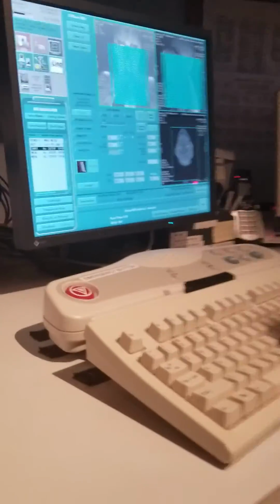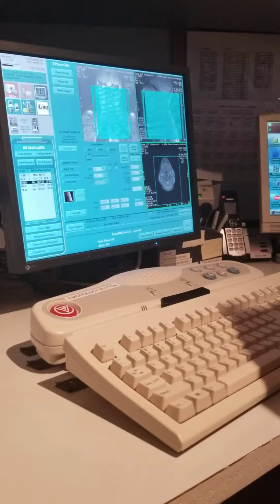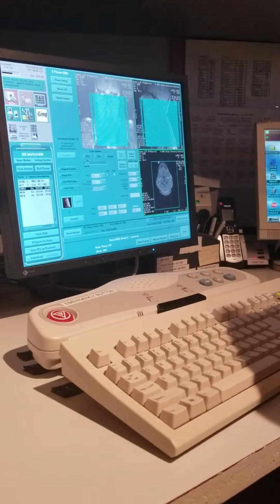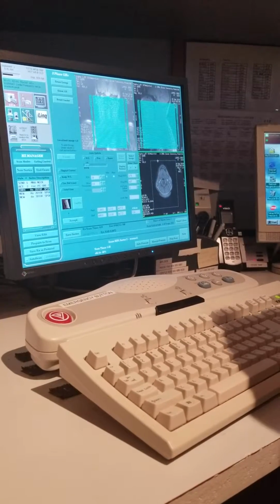I like it. Okay. You can bring the field of view anterior a little. Grab this box. Grab it. Okay.